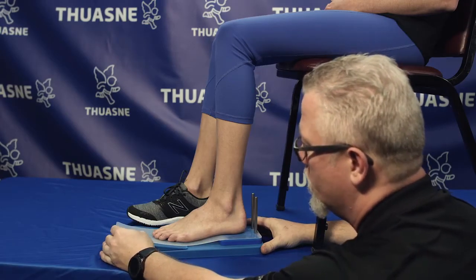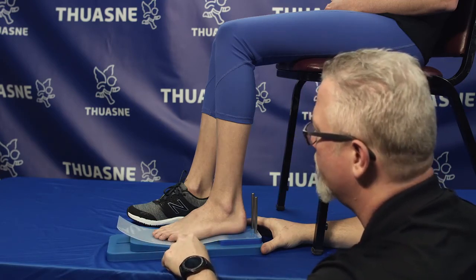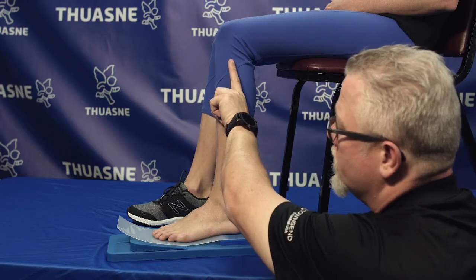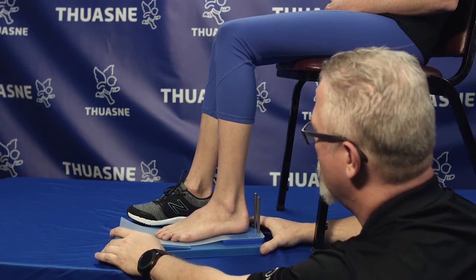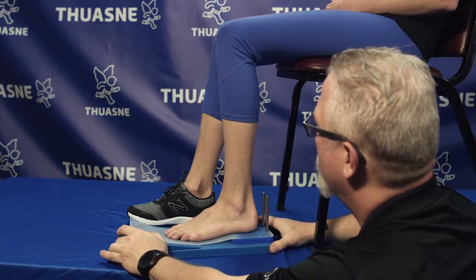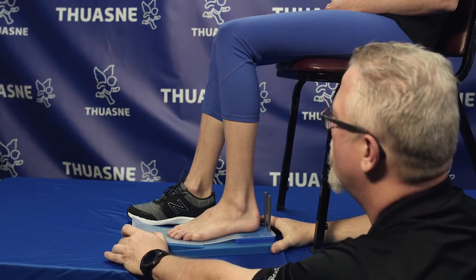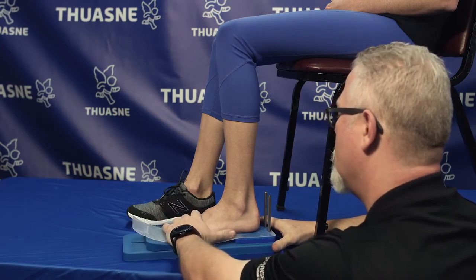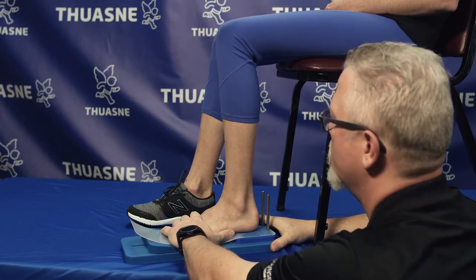Now, we've addressed heel pitch and we've addressed toe ramp. Now we need to get our 7 degrees of tibial inclination to make sure that sagittally we're aligned with the knee over the ankle. So we're going to go ahead and slide the black, and we are aligned. The last thing we're going to do is just double check that our toe out is accurate as well.